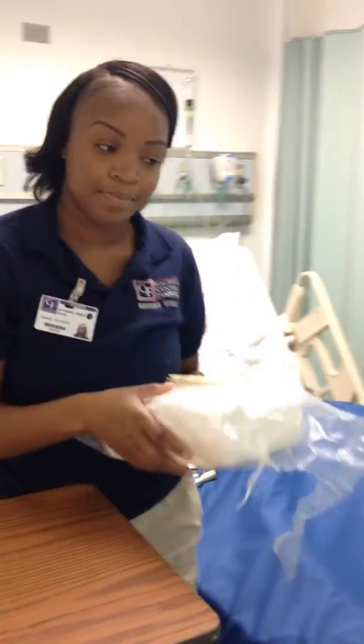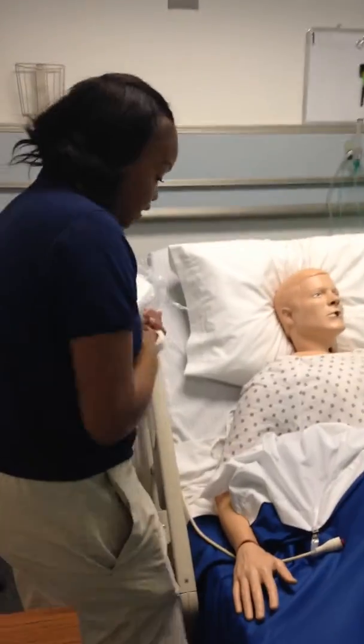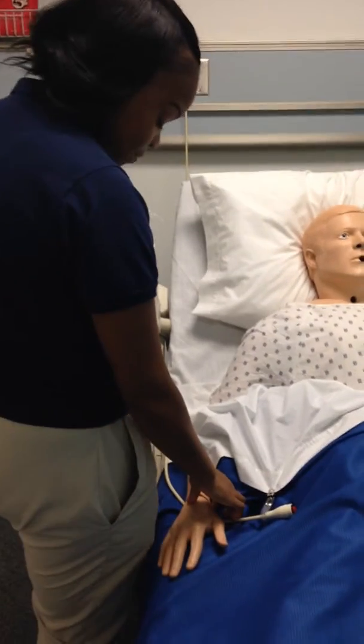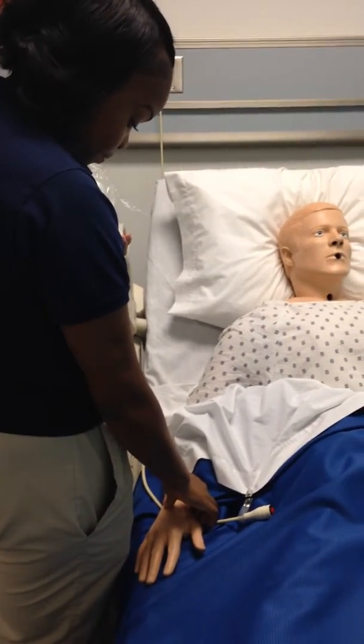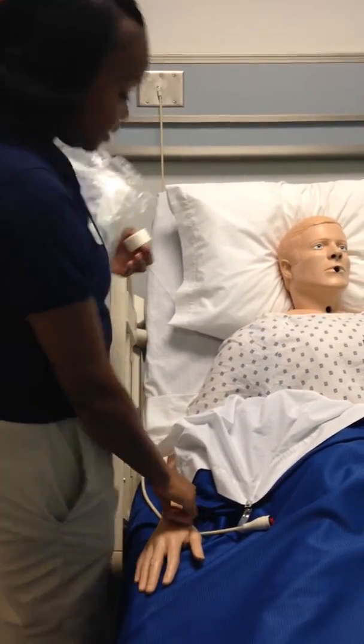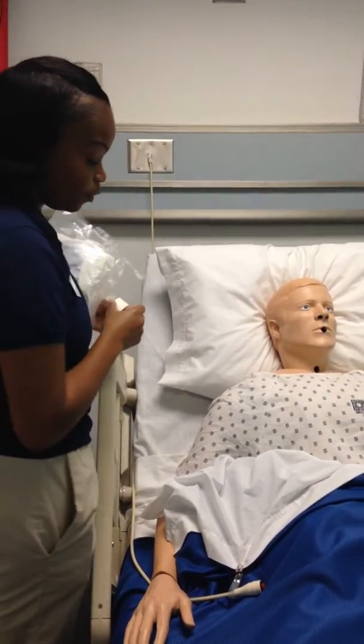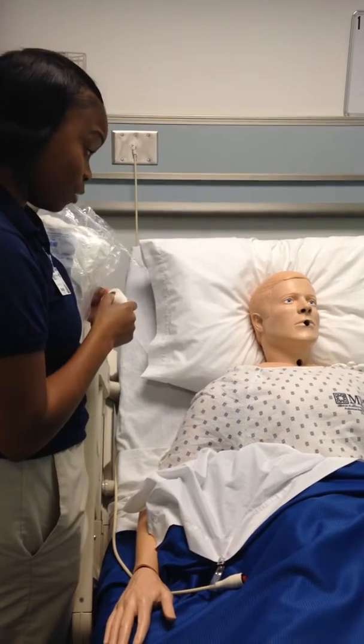I'll wash my hands. Good morning, Mrs. Jones. My name is Tasha. I'm a student nurse. Can you verify your name and your date of birth? Mrs. Jones, 7588. Okay. Her name and date of birth match my order. Mrs. Jones, your doctor has ordered for you to have a Foley placed. Have you ever had one before?